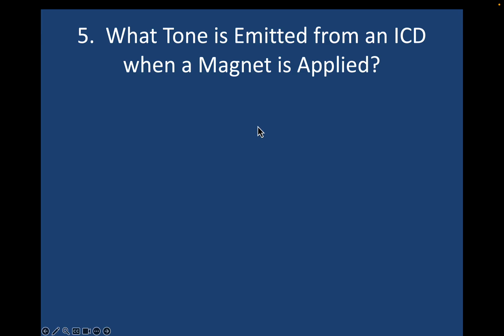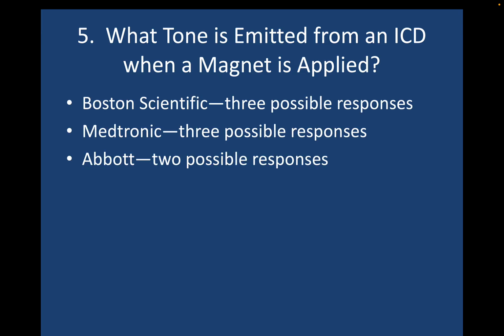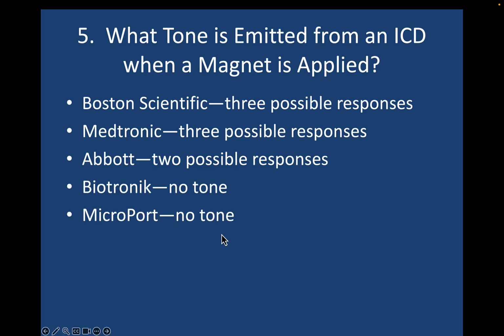This is an important one to know. The answer's a little more complicated than you'd like to hear. Boston Scientific, there are 3 possible responses. Medtronic, 3 possible responses. Abbott, 2 possible responses. And then Biotronik and MicroPort do not emit a tone when a magnet is placed. So let's talk about them.